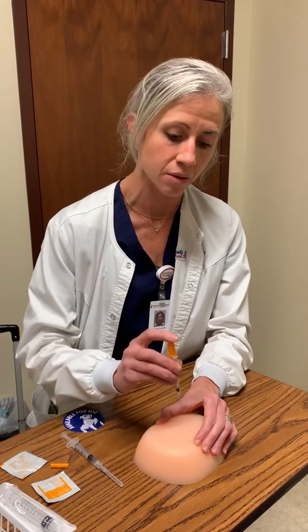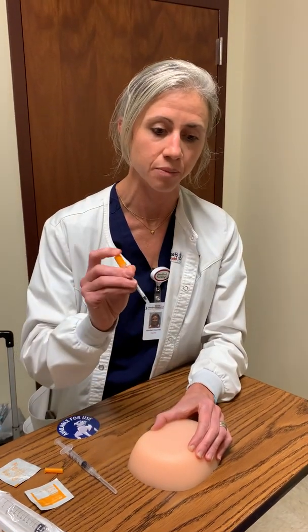And with these, you can do these at 45 to 90. As a rule of thumb, I usually just give mine at a 90, okay? So you're going to take it, you're going to dart it, and you're going to shoot it, and you're going to remove it, okay? Most of the Lovenox syringes will have a safety so that you can push it up. Okay, so make sure you've done that. And if for some reason it's not working, something's wrong with it, this is gonna go where? Into the sharps container anyway, okay?